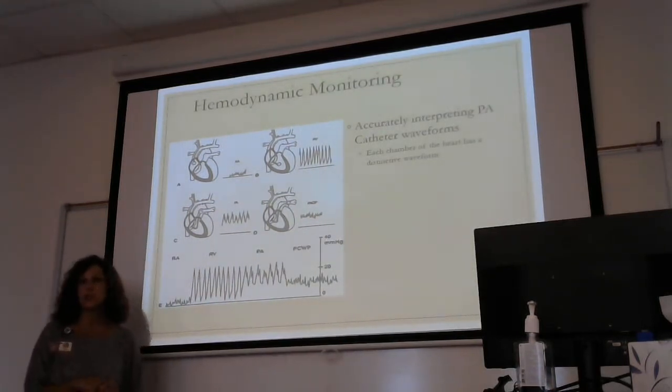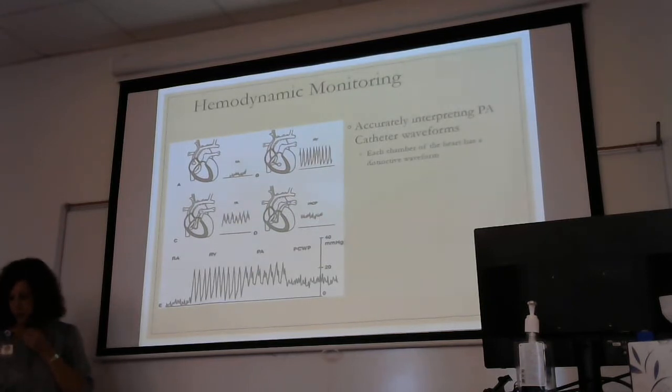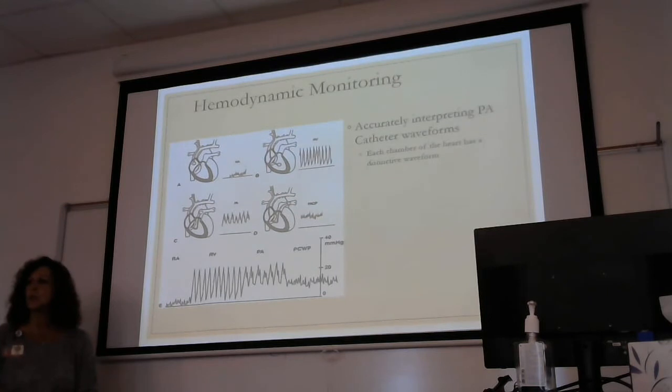When your physician is putting it in, we did so many bedside procedures, but we don't see them as often as we used to, but they still get done from time to time. We put a lot of these in at bedside, and your responsibility as a nurse is to monitor your patient's response to the procedure, knowing what the waveform is telling you, and being the other set of eyes for the provider who's looking at fluoro to determine where they need to go.